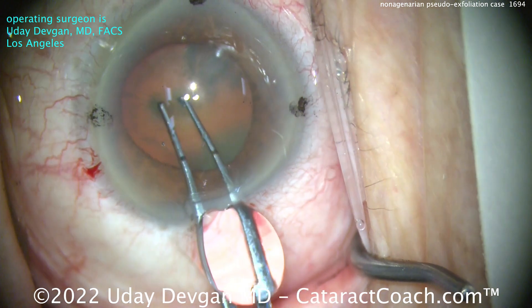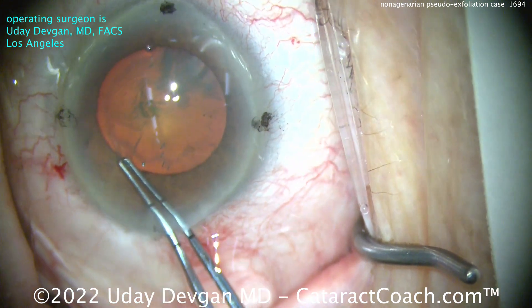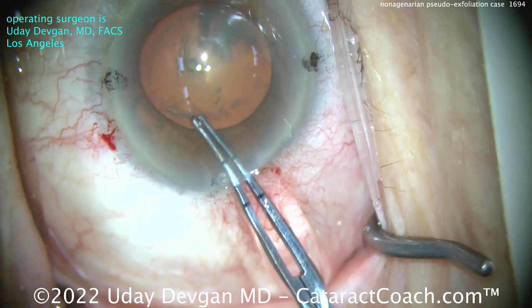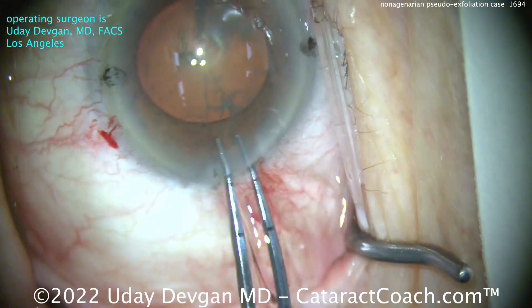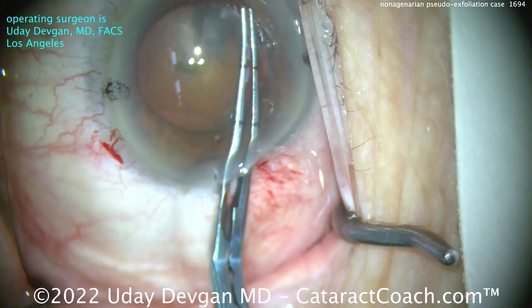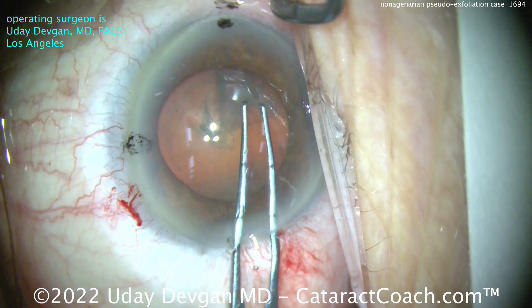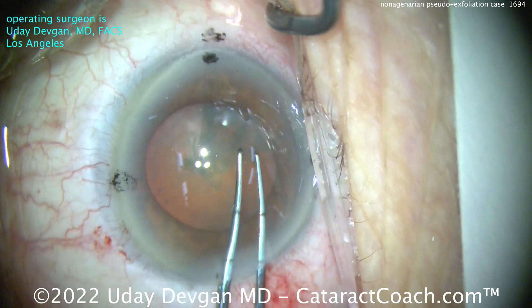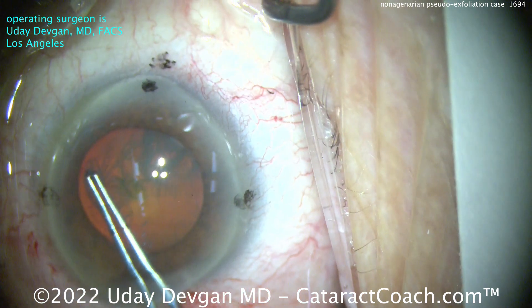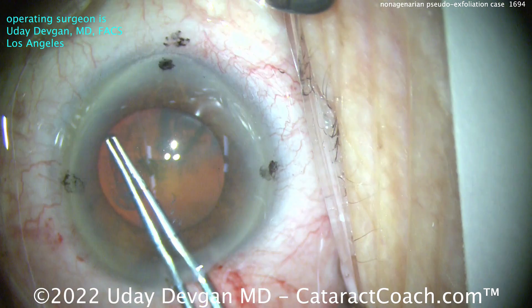Measuring with the forceps — that's a barely five millimeter pupil. So I want to get this rhexis done, and this rhexis better be as big as that pupil. Getting that rhexis here, you want the edge of the rhexis right up against that pupil. Fortunately, there's no wrinkling of the lens capsule, so capsule stability looks pretty reasonable. The patient is a little bit on the hyperopic side with a slightly shallow anterior chamber, but the eye power in this case is about 23 diopters. Getting that rhexis done and completing it here.